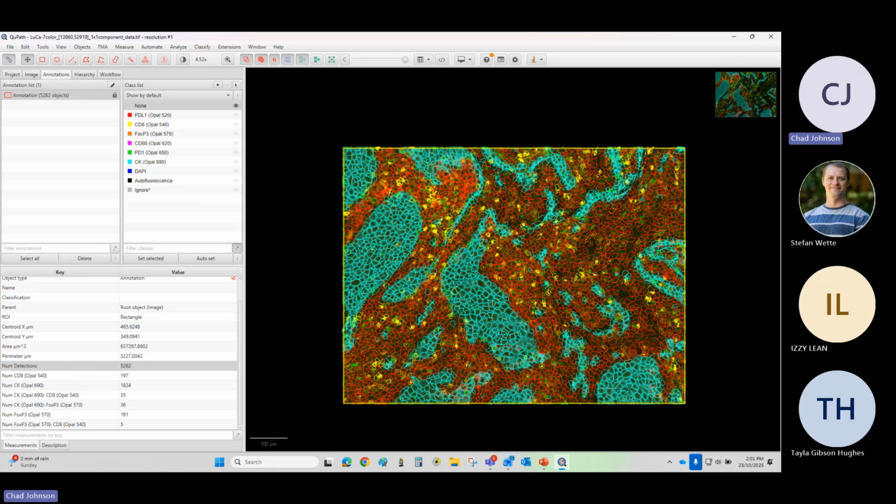Knowing when to quit is that if your data set is not up to par, like if you've got obvious artifacts with your staining, if your imaging wasn't good enough, etc., etc., basically either you can just do it manually, or go back and do it again. Make sure the data is actually up to scratch for training the model. Because remember the old adage, garbage in, garbage out.